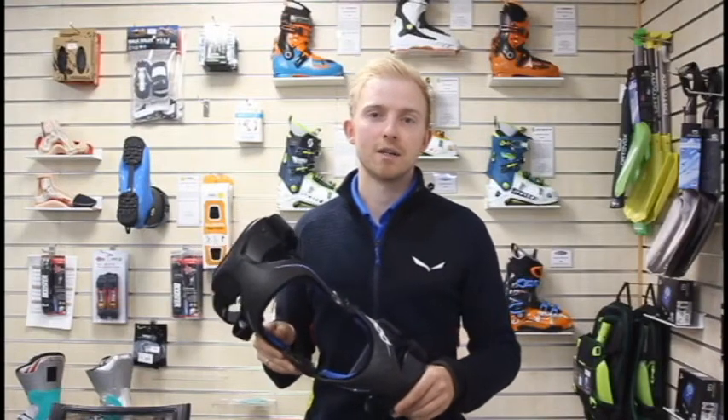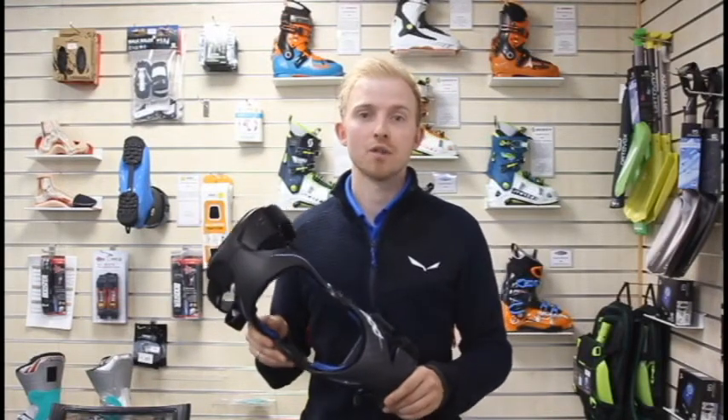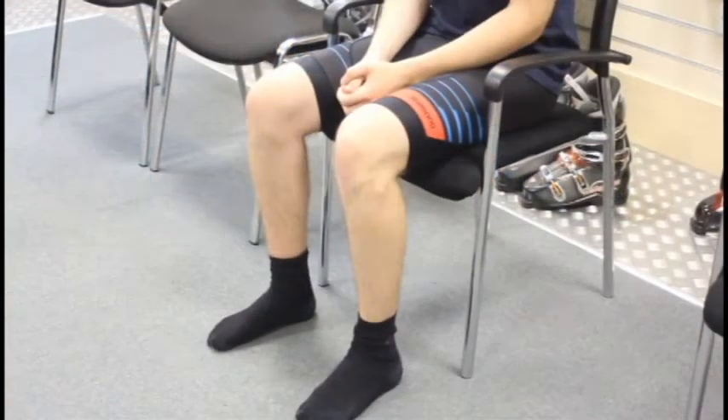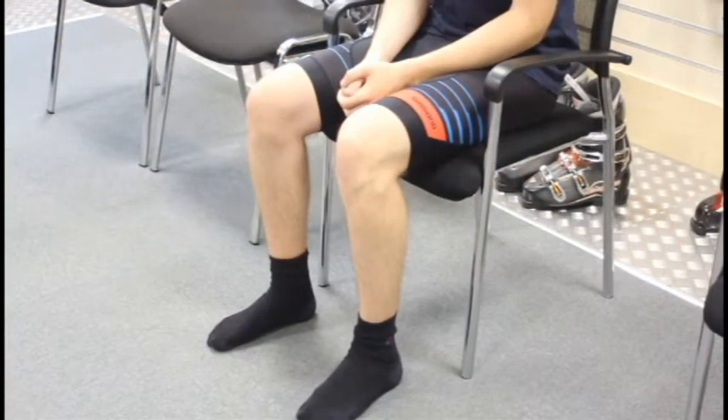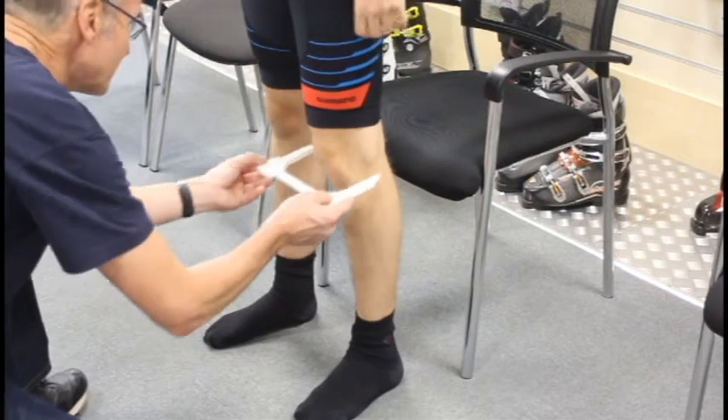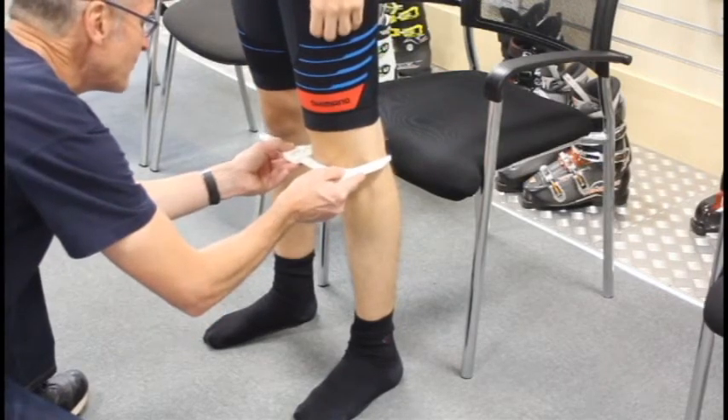Hi, I'm Calman for Medical Technical, and this is the POD K8 Carbon Knee Brace. The POD Knee Brace comes in four different sizes and it's very easy to size. Simply measure around the mid patella.